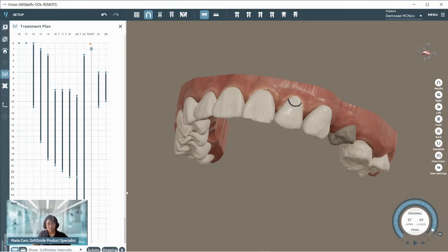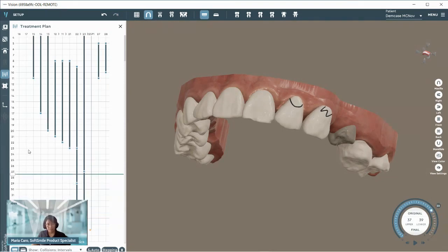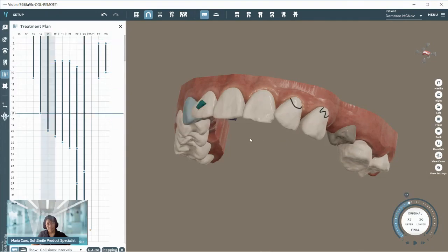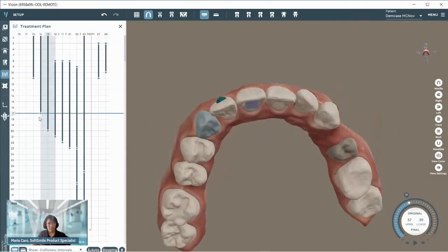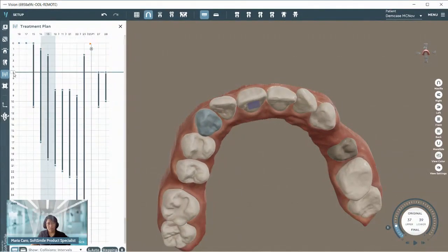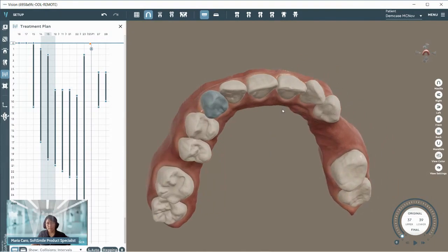Notice that things also disappear during the treatment plan. That's because we have full control of when they activate and when they deactivate. So, how do we add these accessories and how do we control the timeline for them?